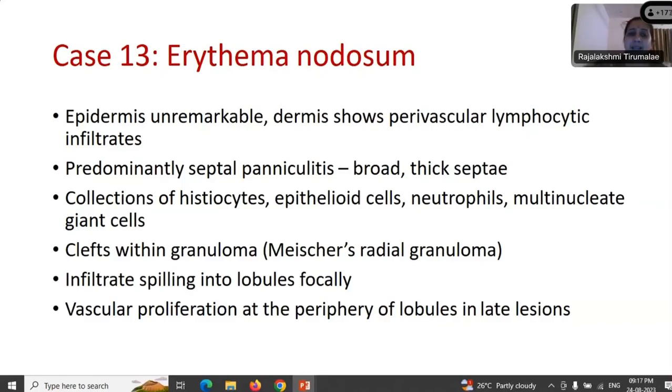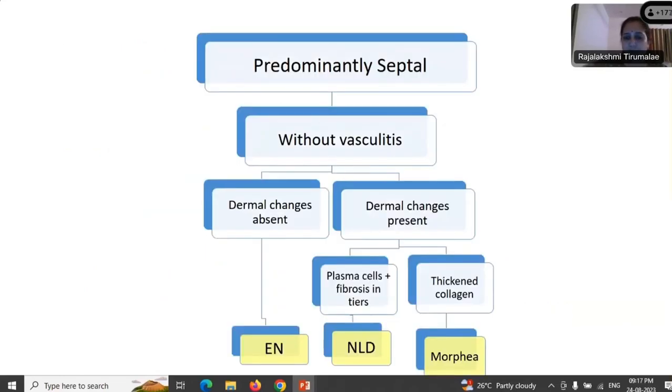It's something akin to granulation tissue that we see. So we don't see the typical features in the late lesion, and clinically also it appears just like a bruise. So the lesions would have even flattened out by then. Okay. So that is erythema nodosum, and this is the differential predominantly.